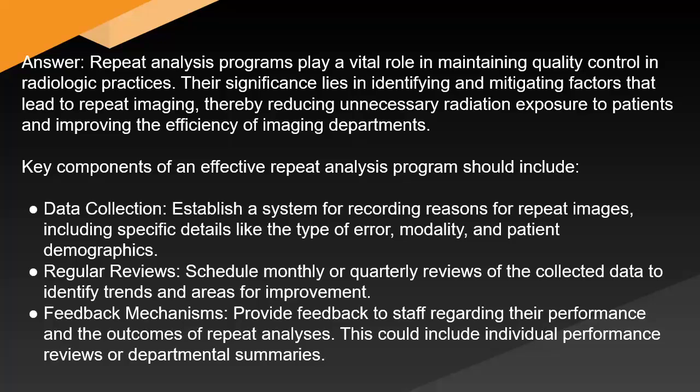Key components of an effective repeat analysis program should include data collection. Establish a system for recording reasons for repeat images, including specific details like the type of error, modality, and patient demographics. Regular reviews. Schedule monthly or quarterly reviews of the collected data to identify trends and areas for improvement. Feedback mechanisms. Provide feedback to staff regarding their performance and the outcomes of repeat analyses. This could include individual performance reviews or departmental summaries.